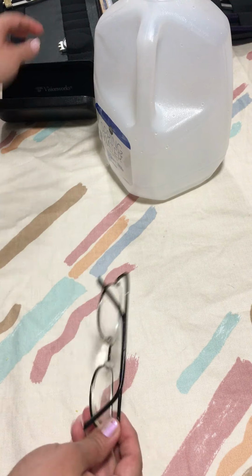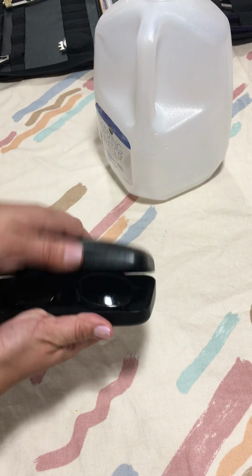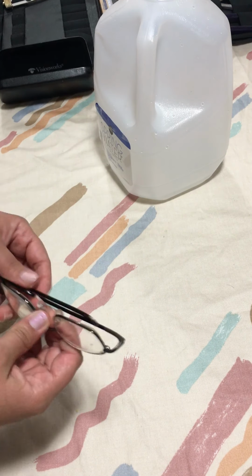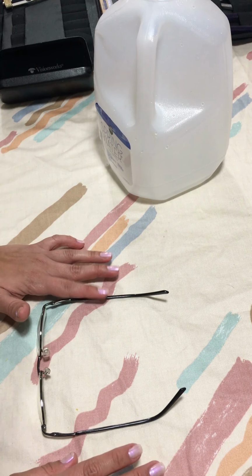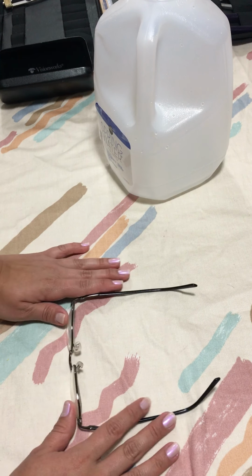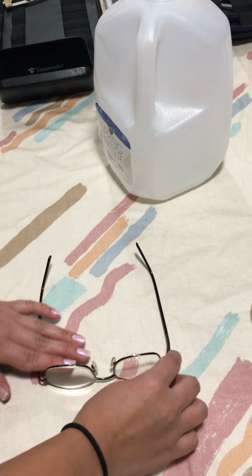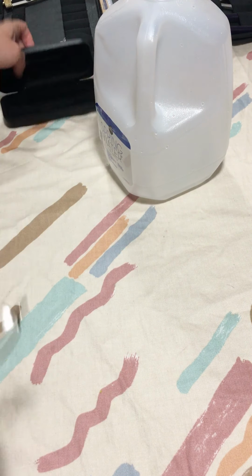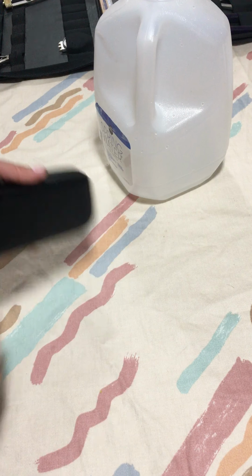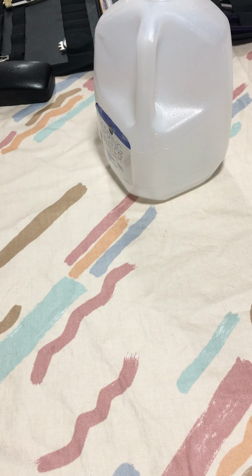So again, we have a good temple fold, okay? Fits on the case well. Now we gotta check that we didn't change anything. Okay, everything's good now. There is no temple parallelism. Everything is good, and the temple bend is good. So the patient should be happy and ready to go. And those were temple misalignments on the patient. How to identify them and how to correct them.